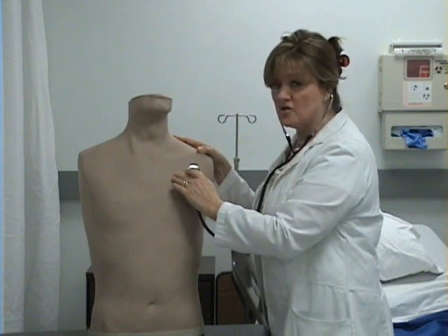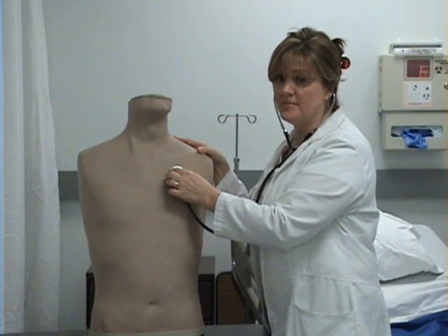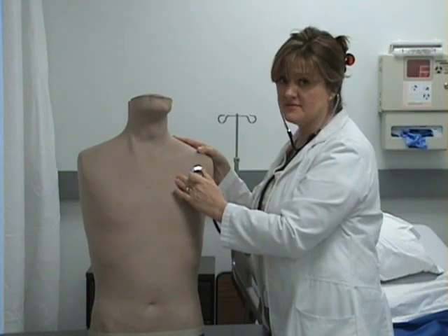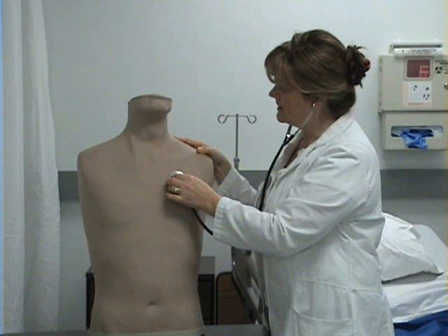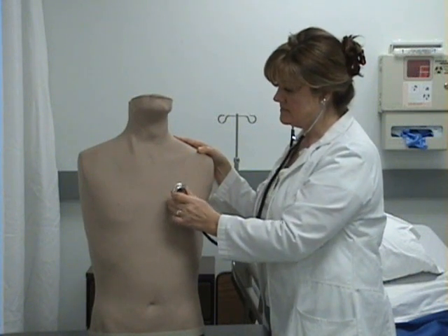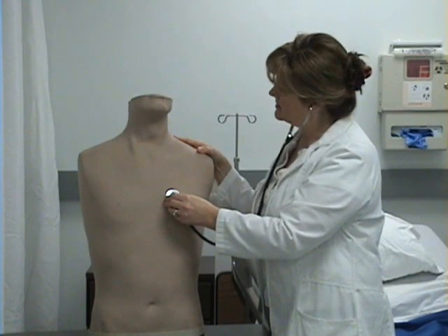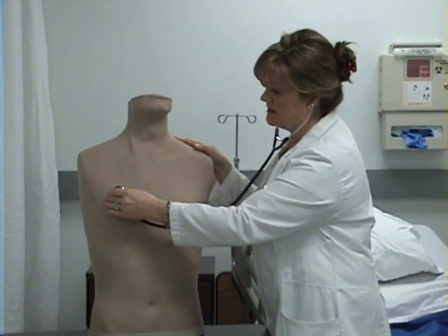Now I need to move across and listen at the same location on the other side, because I need to compare these lung sounds to the lung sounds on this left side. And if you could take a deep breath in and out. Now I'll move my stethoscope straight down. Again, not listening over bone. Deep breath in and out. And I'll compare side to side.